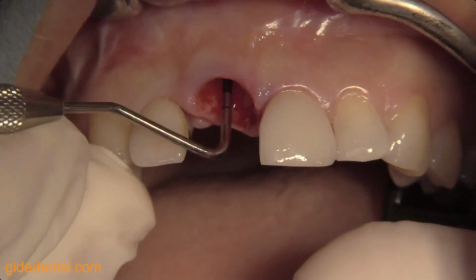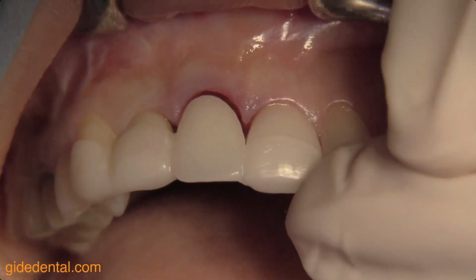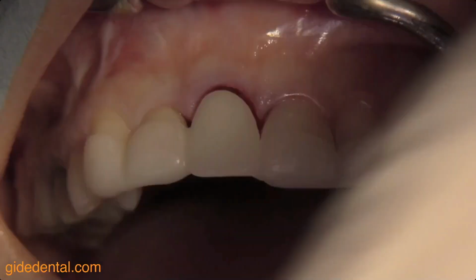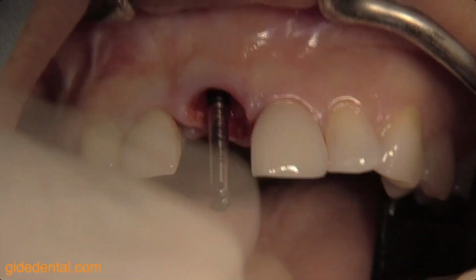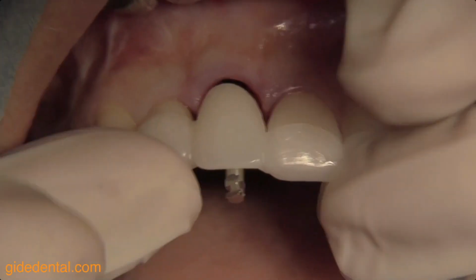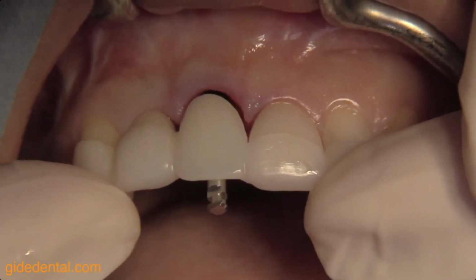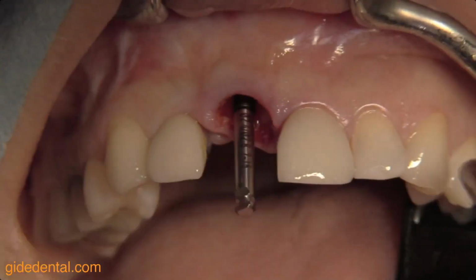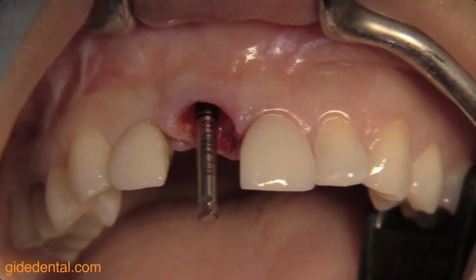Because this is freehand, I'm just evaluating this carefully. Remember, this is an aesthetic implant placement. So the more confident I am to place the implant in the accurate position, the better it is. That's a 2.8 millimeter drill. I'm just checking again here the position. So I'm giving myself an eye matching control. So I want to see exactly where is this drill ending.